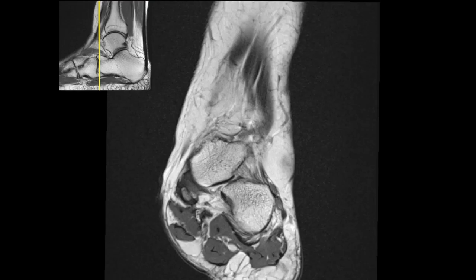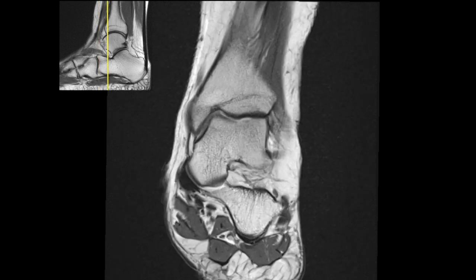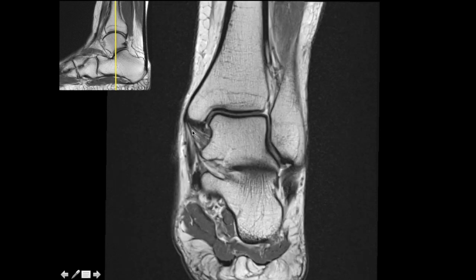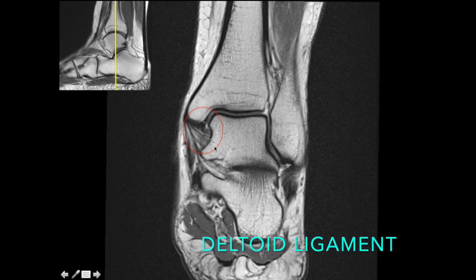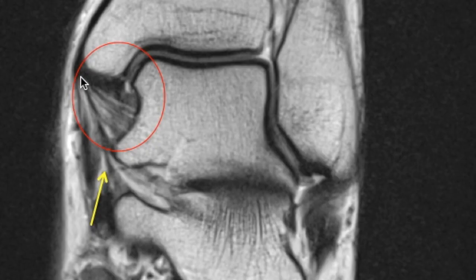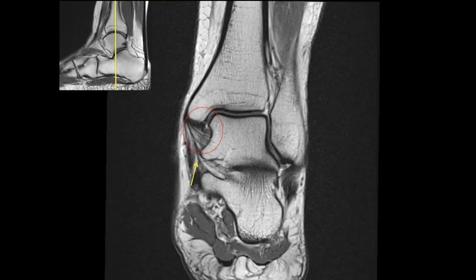Now we look at the coronal planes, going from anterior to posterior. First we look at the bones and cartilage: tibia, talus, and the tibiotalar joint. Make sure to look at the medial and lateral talar domes for any osteochondral lesions. Medially, the medial ligament complex comprises the deltoid ligament. The deep fibers of the deltoid go from the medial malleolus to the talus — this is the tibiotalar ligament. It normally has a striated appearance with hyperintense signal because of the fanning out of fibers, similar to the posterior talofibular ligament, and this should not be mistaken for a tear. The deltoid also consists of superficial fibers going from tibia to the calcaneum, navicular, and the spring ligaments, but the deep fibers are clinically more important.